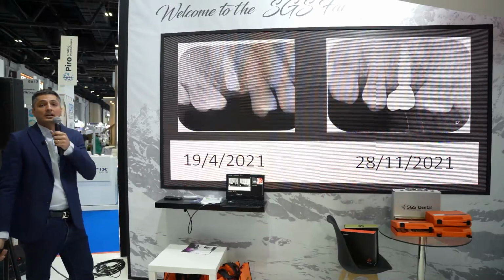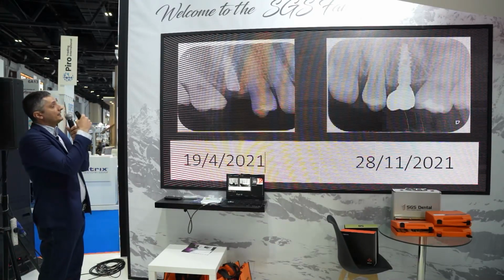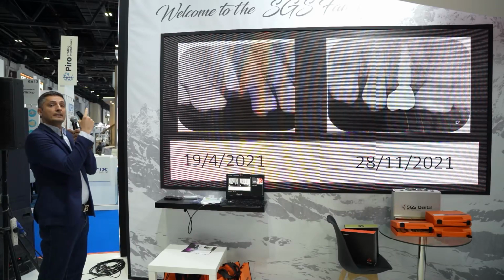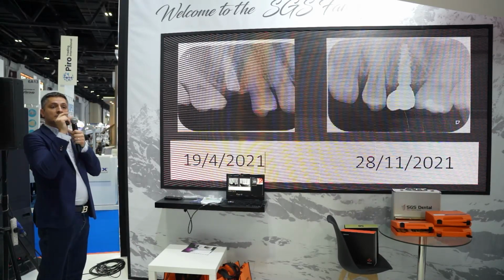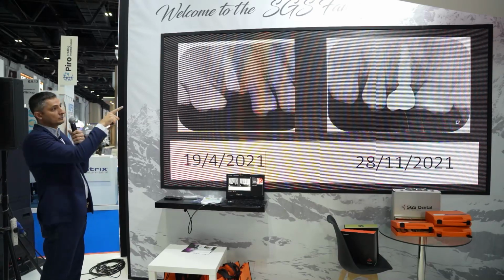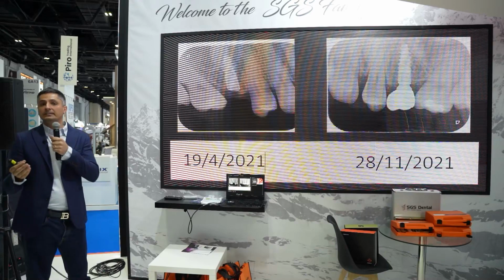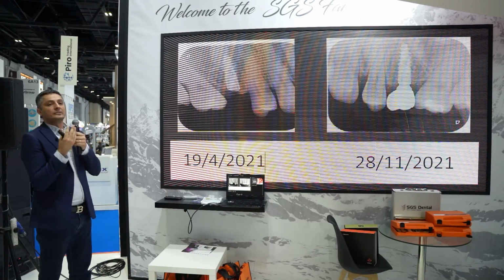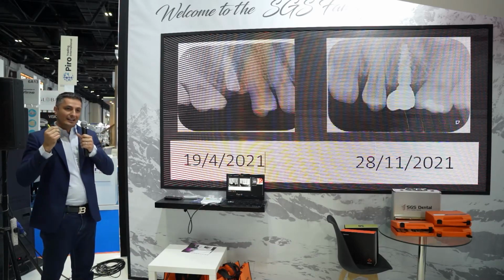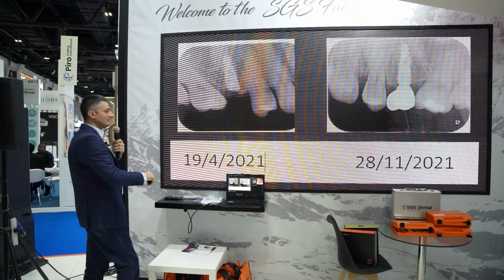Even with the P5D, we can do an internal sinus lift. I elevate the sinus, I do the preparation, then I will also do the cortical drill, 3 millimeter in the maxilla, to get this result. Don't be afraid to lose this stability, this insertion torque. Don't be afraid. We are using some aggressive implants. They are aggressively very stable when we are putting these implants.